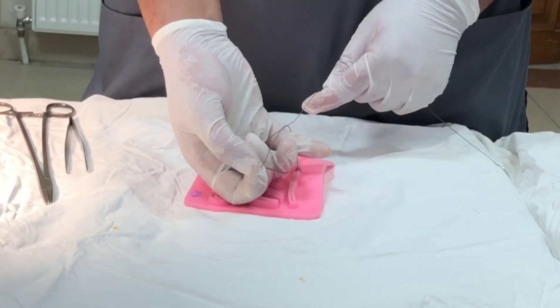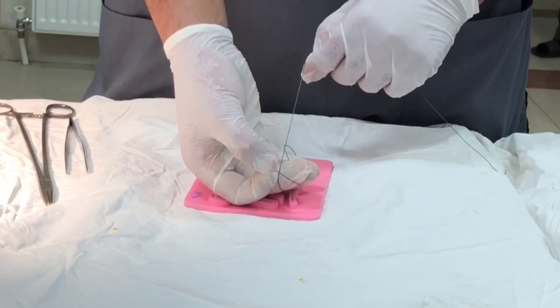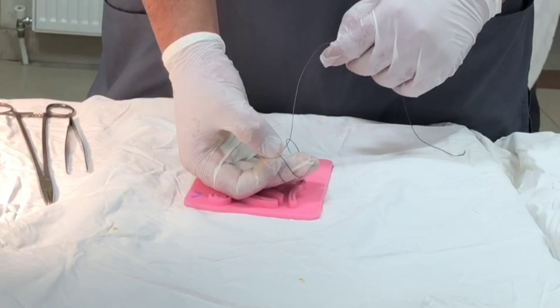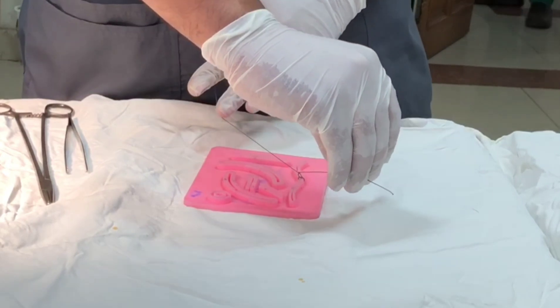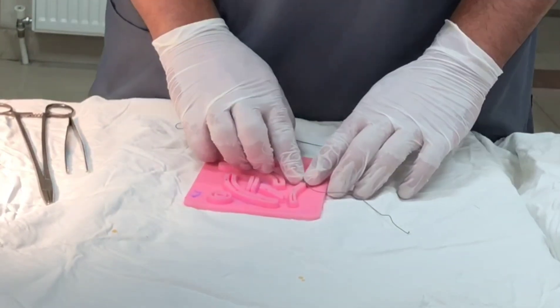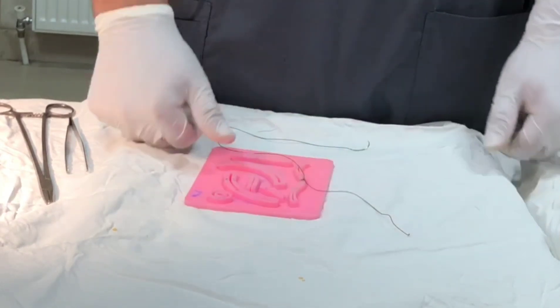Fish it out with the middle finger and secure with the ring finger, come out. Now you have to tie in the opposite direction for securing the knot. This completes the one-handed reef knot.